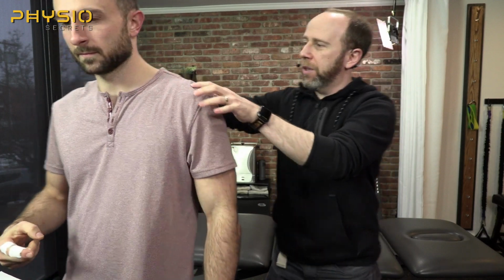So that's number 1. So that was taping the mechanical principles. Now let's do a neurological tape job, and let's do it for the cervical spine. So go ahead and turn around. We can back up this way a little bit.